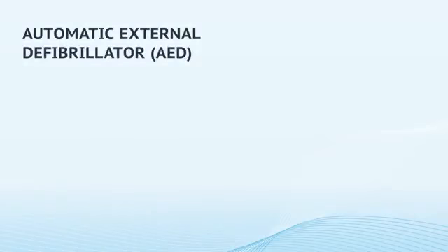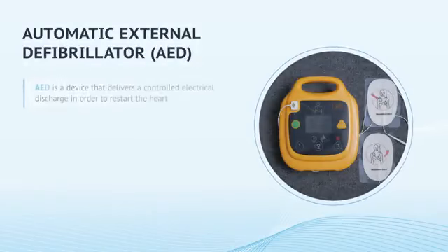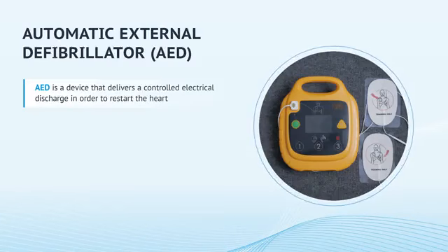What is an automatic external defibrillator? AED is a device that delivers a controlled electrical discharge in order to restart the heart. It is important to know the AED is your assistant and, in a sense, the leader of your actions. It will tell you what to do and will produce an electric discharge. However, it will never replace your actions. Therefore, if there is an AED nearby, be sure to use it while performing CPR.